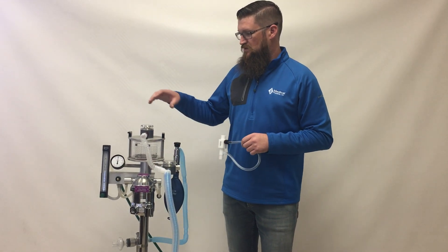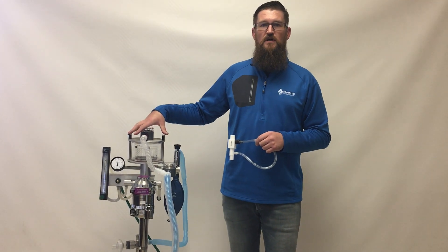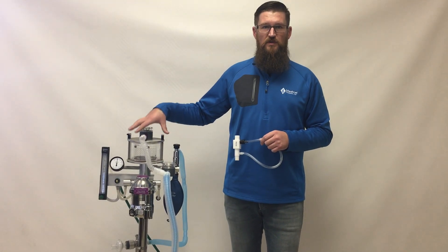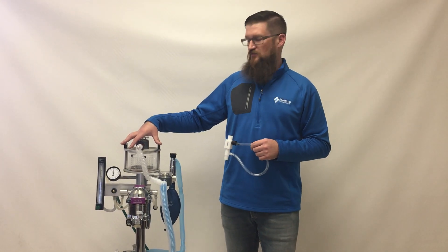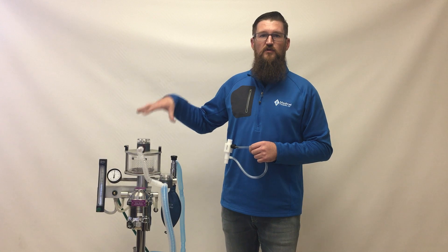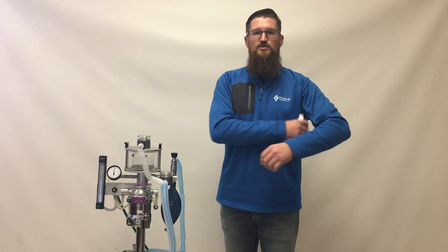I'm going to demonstrate the function of the anesthesia machine without the safety relief valve, then attach the safety relief valve and see how they operate differently under emergent situations involving the pop-off valve, occlusion valve, and general use.